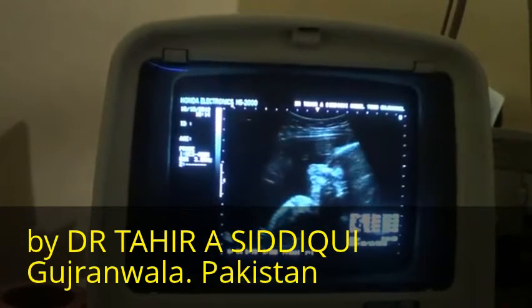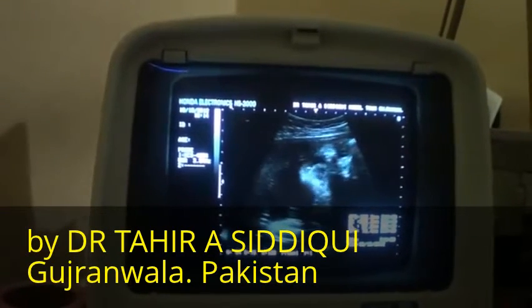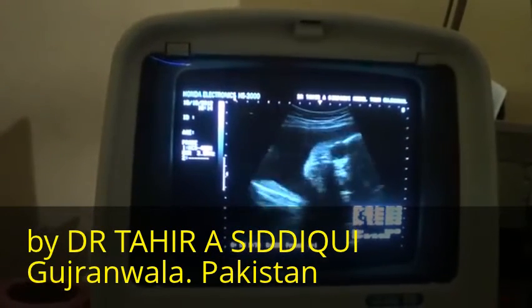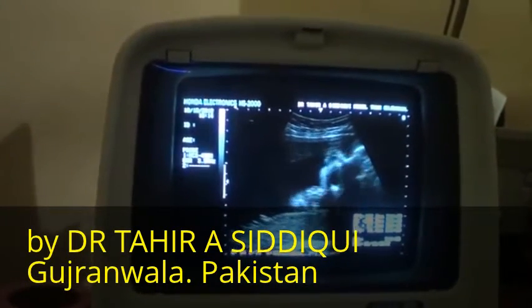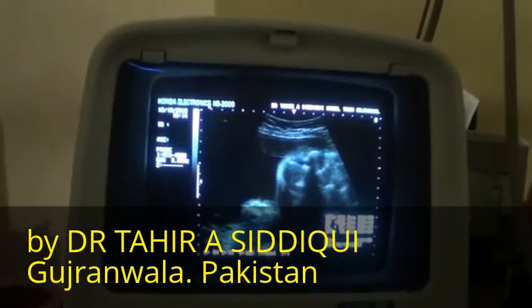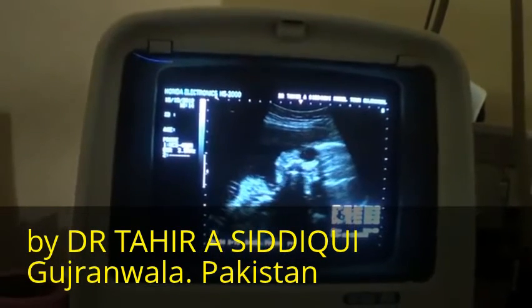No anomaly is seen relating to the fetal face. Now you can see that there is another eye. The second eye is also visualized. See the activity of the patient, how active the fetus is.